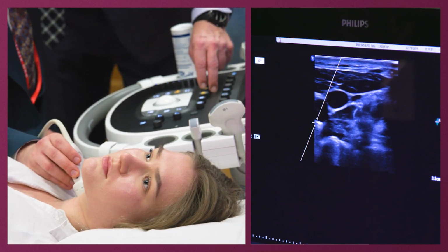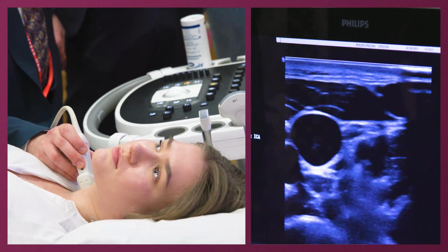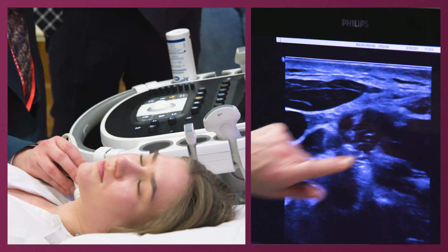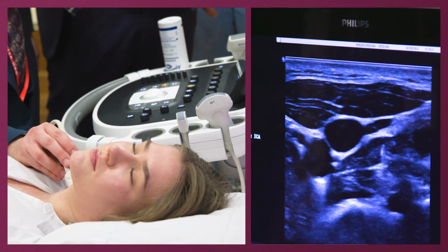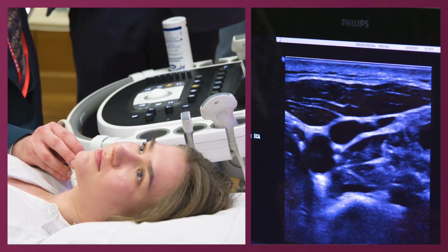And then put your arm on the shoulder. I remove the collar and I remove this, and then you get close to where the neck starts. More, exactly, and see what's going on here. So you have something here and something here. You need to put this into the center of the image. So you have to, yes, more. Even look at the screen. And from now on, you're not allowed to look at the patient, only look at the screen. I'll tell you if you start looking at the patient.